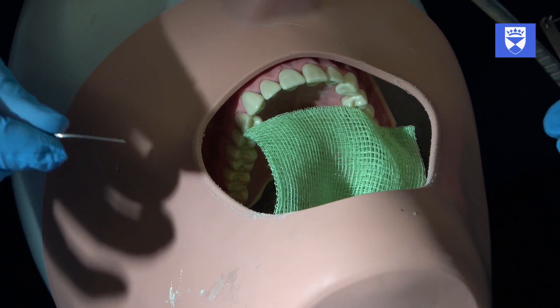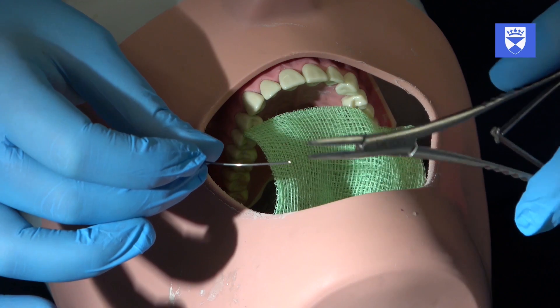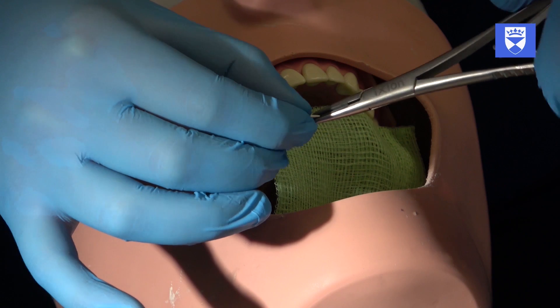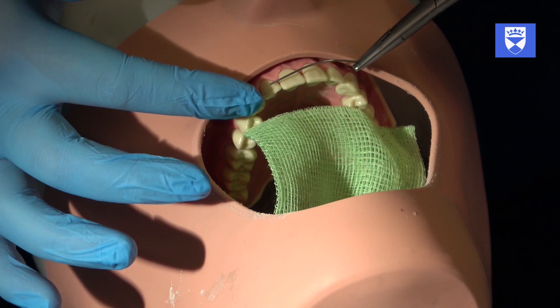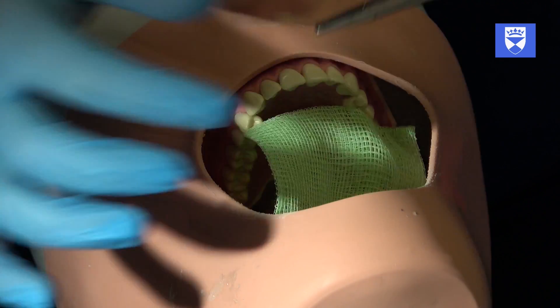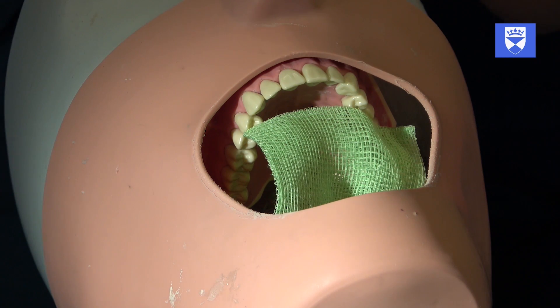The safety handle parts of the splint will be disposed of in the sharps bin, and for the remainder of the procedure the splint will need to be held in a locking instrument. An alternative method would have been to pre-cut the wire to an estimated length and compare it against the teeth while held in the locking instrument from the beginning. The airway can also be protected at this time with gauze. We will now make a final comparison of the splint against the dentition to confirm it is the desired length and shape, and we are ready to place the splint.